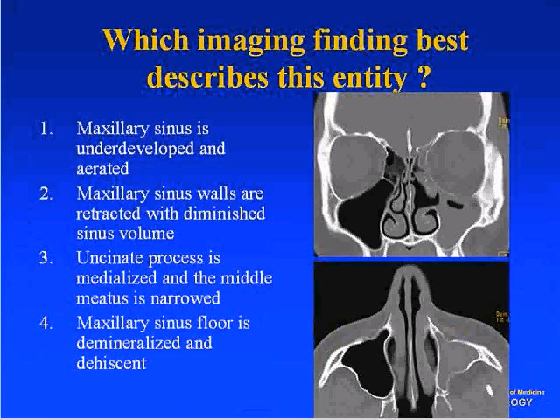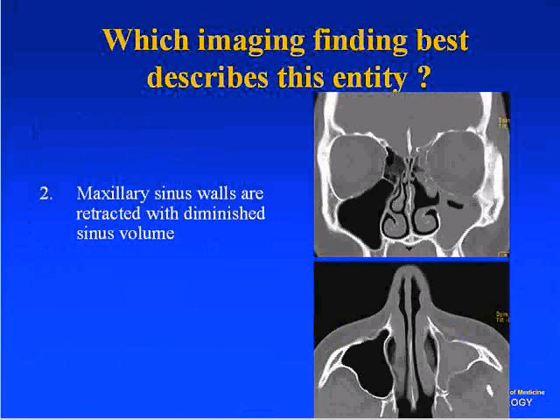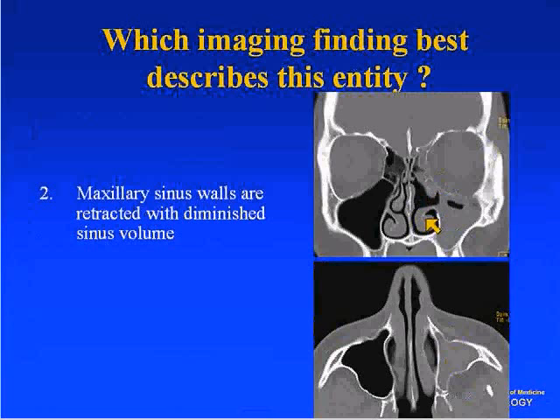On the axial image, the lateral wall is retracted and the retromaxillary fat is enlarged. It is typically the orbital floor that herniates downward into the maxillary sinus, resulting in the patient's symptomatology — often presenting with visual changes or pain. The other key finding is the enlarged middle meatus, with the uncinate process typically lateralized.